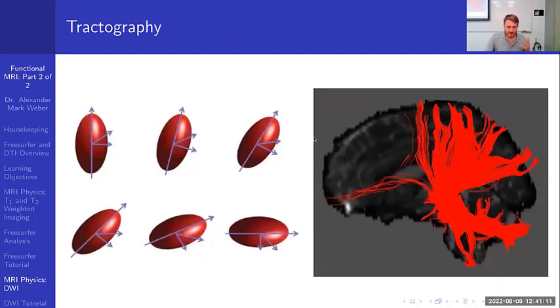So another example of what you can do with diffusion weighted imaging is something called fiber tracking. So it's a pretty simple concept once we understand the FA stuff. Axonal tracks are commonly mapped using something like a deterministic method, although there are other methods, probabilistic, and so on.